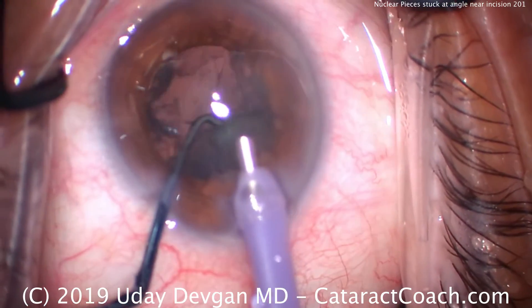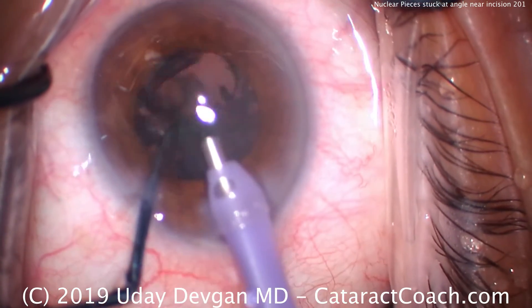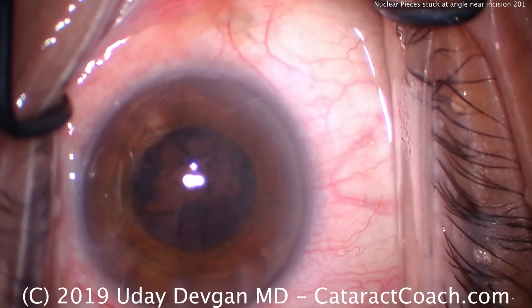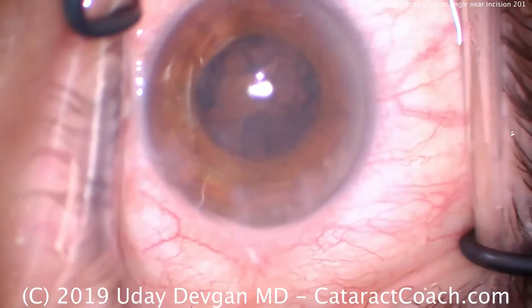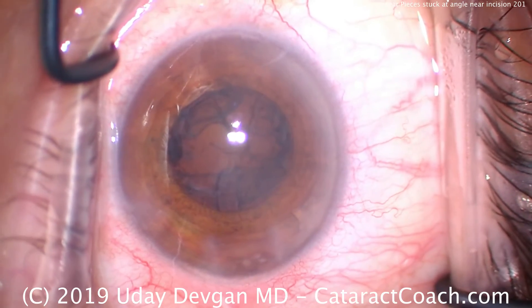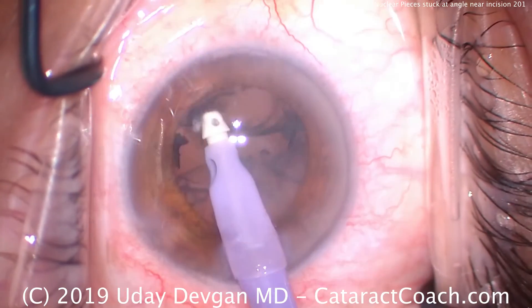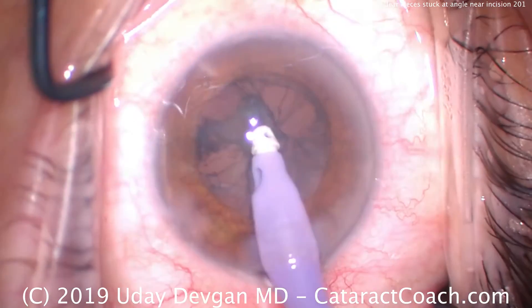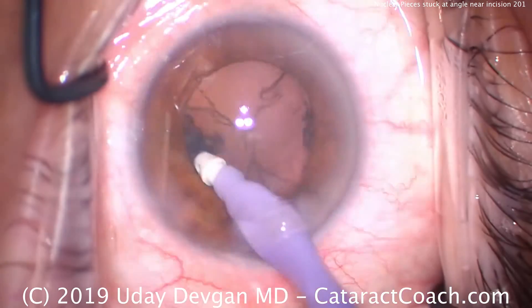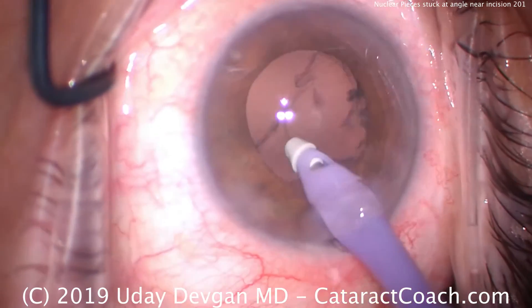If we just try to pivot the probe and retract it from the eye, you could lose infusion. Remember, the infusion's coming through those side ports of the tip. So if you retract the probe too much, you'll lose infusion, shallow the anterior chamber, you could even break the capsule or damage the iris — and we certainly want to avoid that. So again, the technique here is: pull out of the eye, get balanced salt solution on a blunt cannula, and use that to squirt or pressure wash those pieces out of the angle and into the center of the eye. Inadvertent grasp of iris there — that's okay, just release — and we can keep moving.